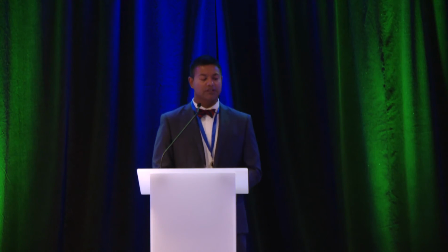After the study is performed, the catheter is extubated and held in midair. We can use the red study cursor to move over that period and use the software tool for setting thermal compensation to help address this discrepancy. Vascular artifact. We can have cardiac or vascular structures that impede our interpretation of the study, as we see here from the aortic arch. Asking the patient to tilt slightly to the left while supine for the study can help those structures fall away from the esophagus and allow for better interpretation of the study.